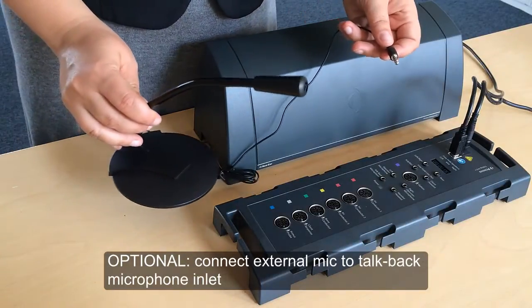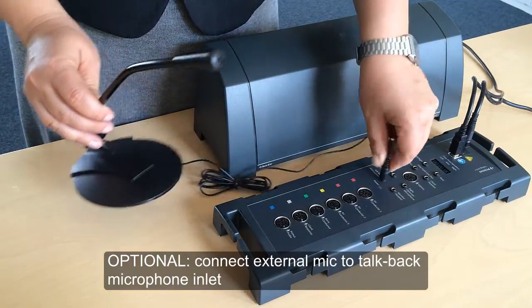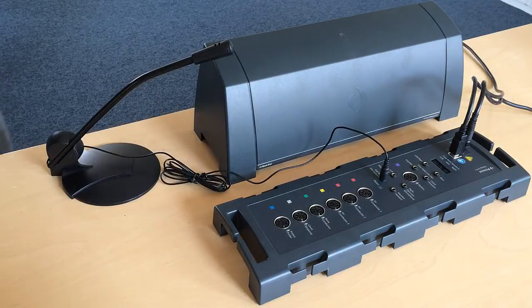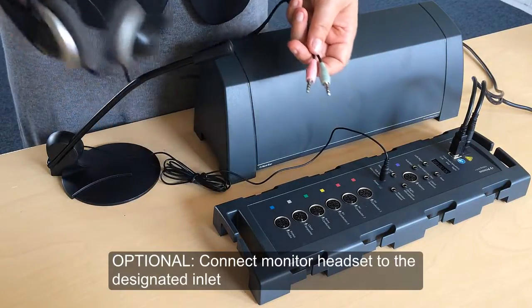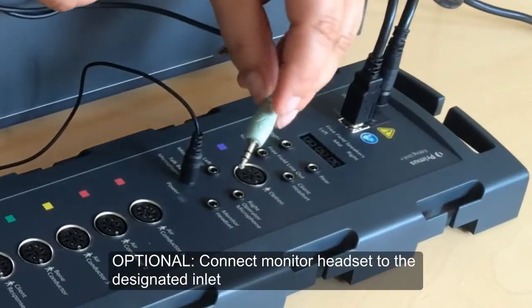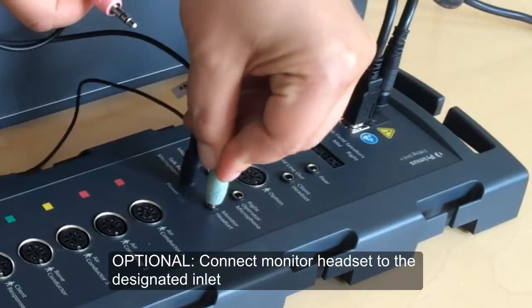If you ordered a talkback microphone to use the talkback functionality, then connect this to the talkback microphone inlet. Likewise, if you ordered a monitor headset, connect it to the monitor headset labelled inlet and connect the microphone to either the right or left operator microphone inlet.